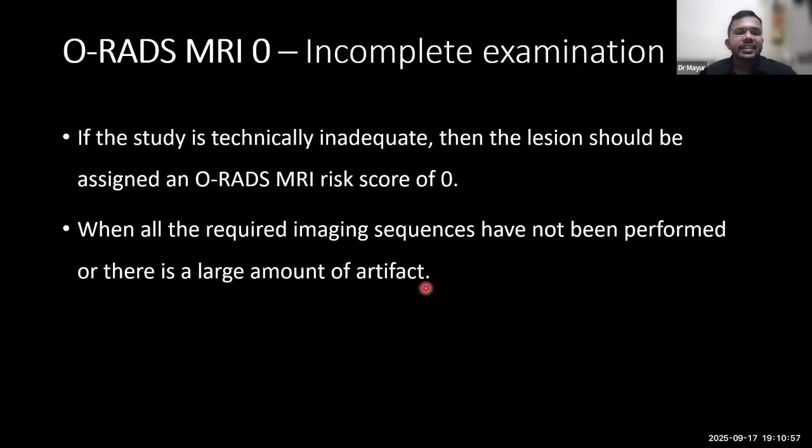Coming to different O-RADS categories, O-RADS 0 is incomplete evaluation, where the study is technically inadequate, where not all the required imaging sequences have been performed, or there are a large amount of artifacts seen, which makes the study unreportable.